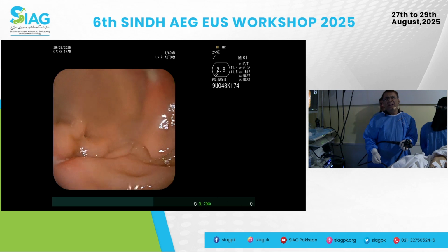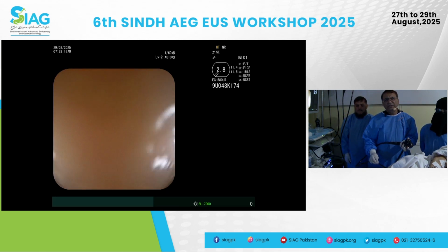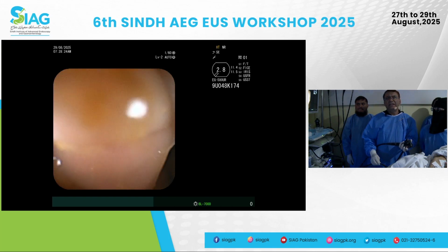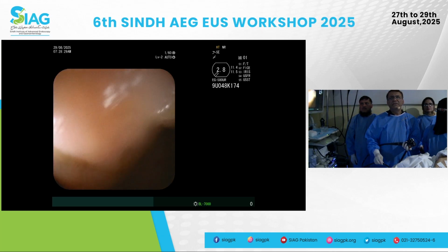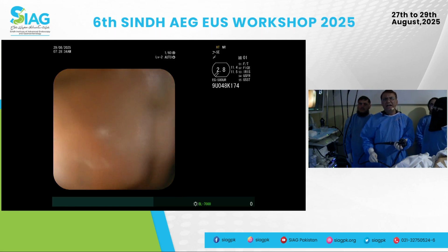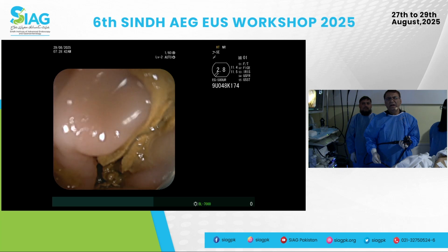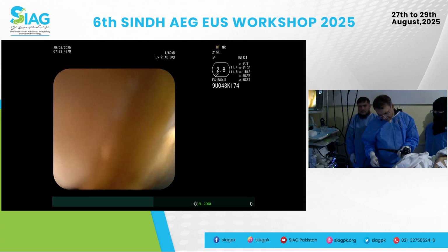Usually 15. With the radial, you can honestly go even deeper, up to the upper rectum. Did you ask about the system? Yes, I was looking and saw that it's Fuji. Yes, this is Fuji radial. Is it a front camera? It should be a front camera in the radial, because radial usually has a camera on the side, but this looked like a camera on the front. I honestly didn't take a look whether it was on the front or side, but it looks like it's in the front because it looks like an endoscope.